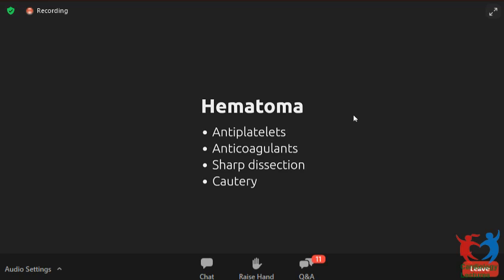Yeah, so two views to confirm. The main problem fluoroscopically is that it can be quite difficult to identify whether you're really in the septum or on the free wall of the right ventricle. Almost all fluoroscopy can be fallacious, and people have shown with CT studies later that you think you're on the septum by fluoroscopy or other criteria, but it's actually not on the septum. So you should try to identify.